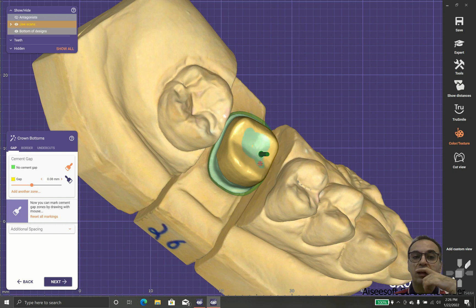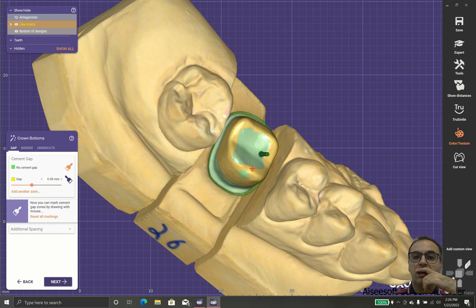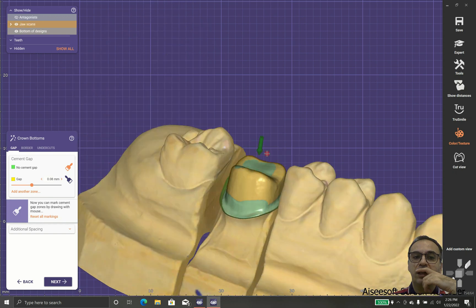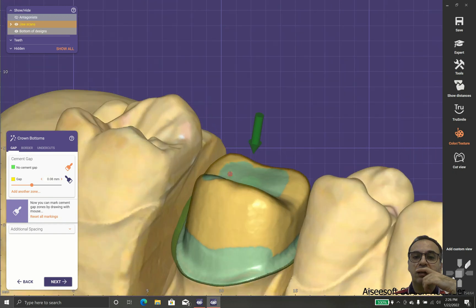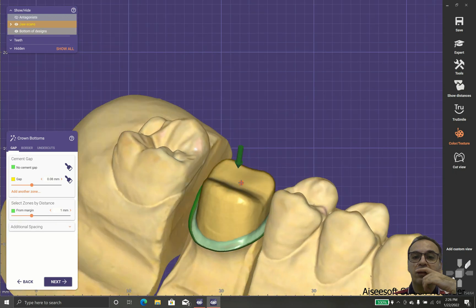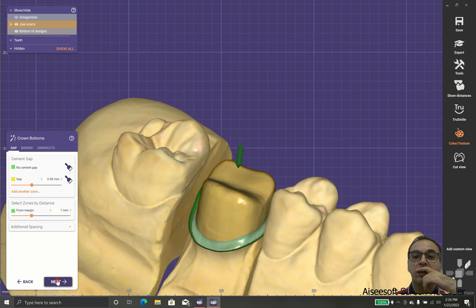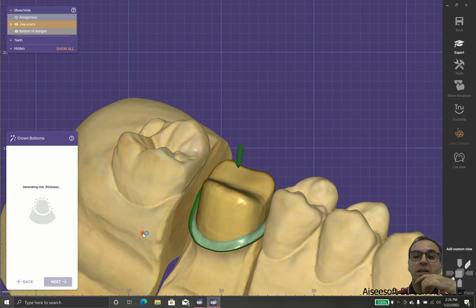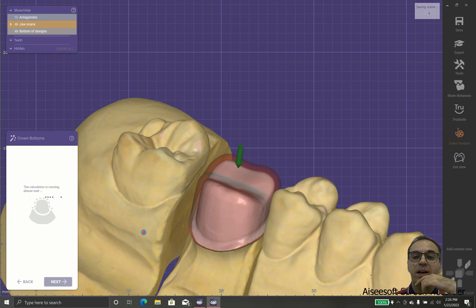We can increase or decrease the no cement gap or add some special part that we don't want gap added.